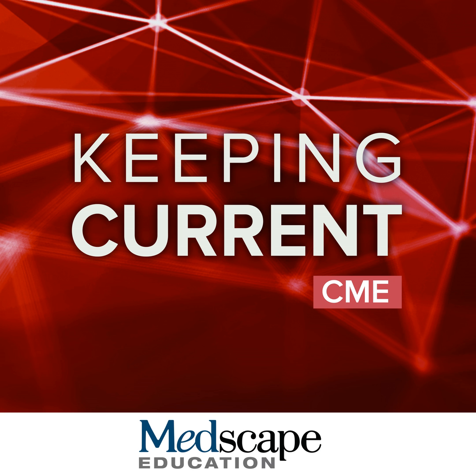The only thing I wanted to add is, of course, I work in a different country, in Canada, with different regulations, and so we don't have access to regadenoson for stress. And Dr. Kwong had mentioned that was one of the stress agents used. So we use dipyridamole with aminophylline for reversal, and that works really well. So I just wanted to emphasize that there are several options for pharmacologic stress for stress CMR, and depending on the country or region you work in and regulations, you may need to be creative about the stress agents that are used.